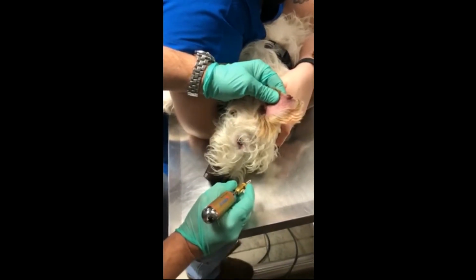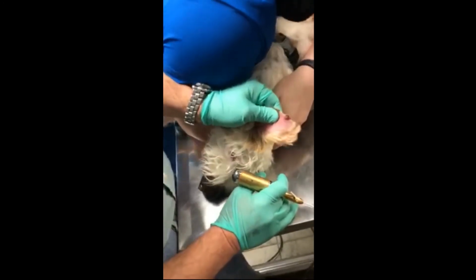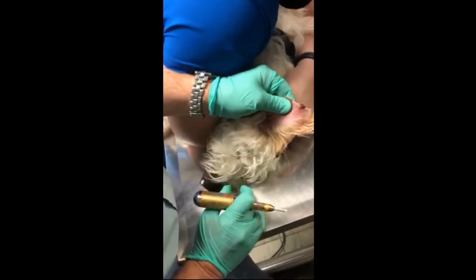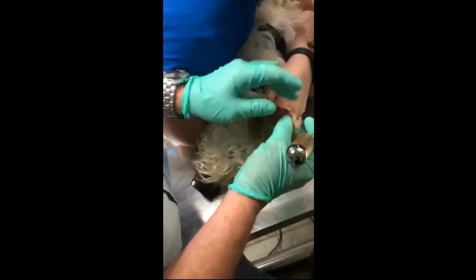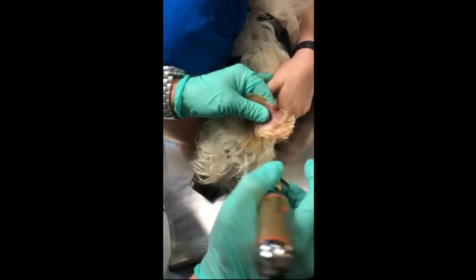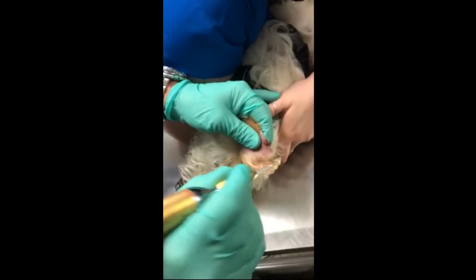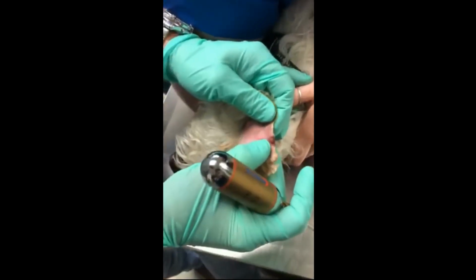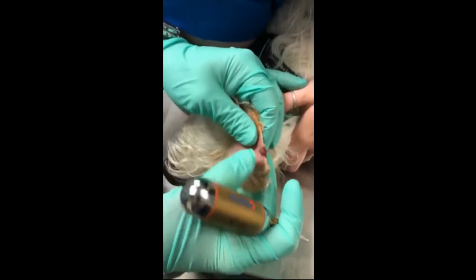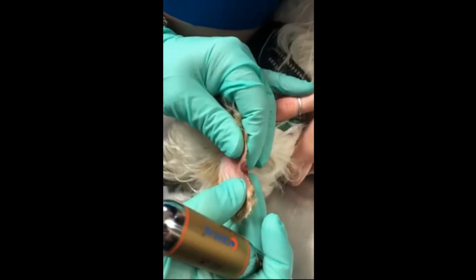This is Doogie. He's a 1.5-year-old wire-haired Jack Russell. The reason for the significant restraint and the muzzle has nothing to do with the freezing procedure. It's entirely due to his temperament. I have both shaved this area and infiltrated with a small amount of lidocaine with epinephrine, only because it's along the ear margin and I suspect it's going to be a little sensitive.